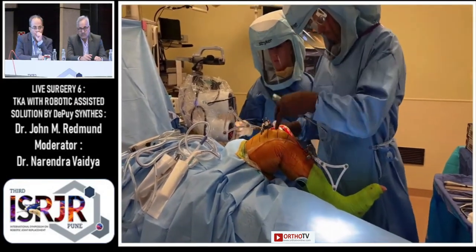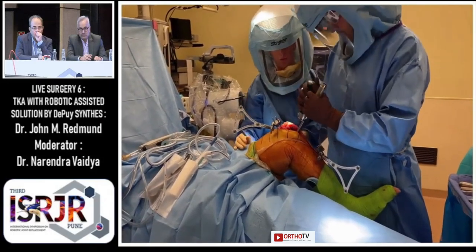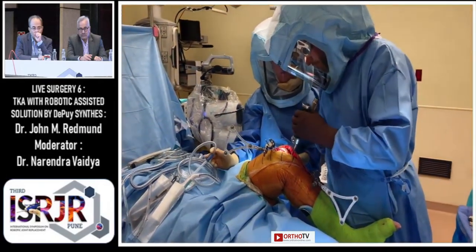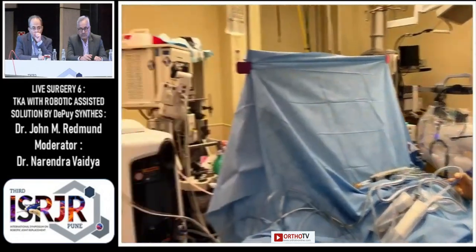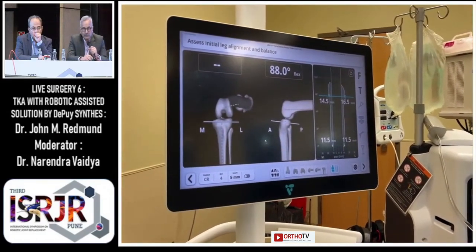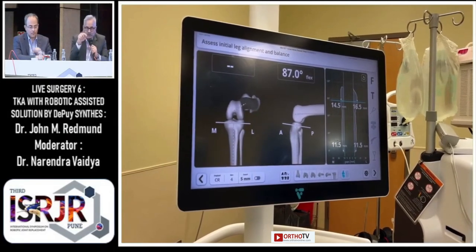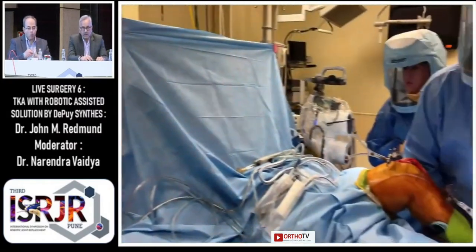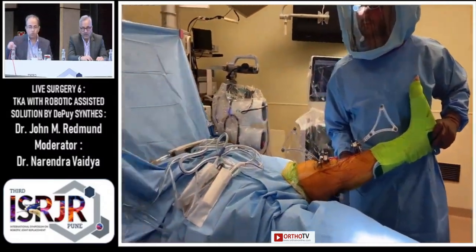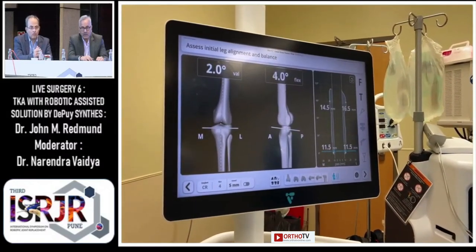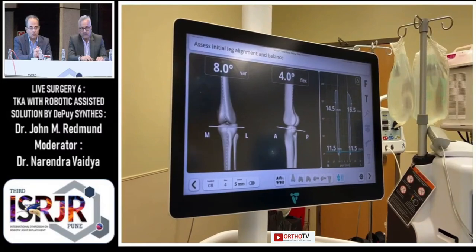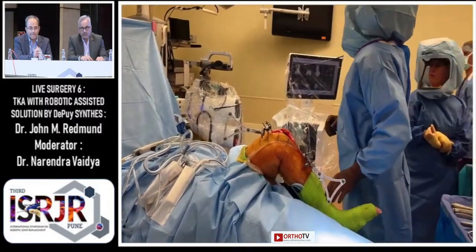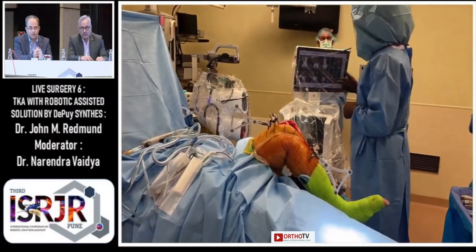As a cruciate-retaining surgeon, I also tension the knee in flexion with both compartments simultaneously to check for PCL tightness. I use a curved osteotome and a cob elevator — instruments already on the field — to tension the flexion space. I then go back and confirm that the numbers on the soft tissue graph are what I want before making any bone cuts. I'll test in flexion and extension at least twice per case before proceeding to plan the arthroplasty.